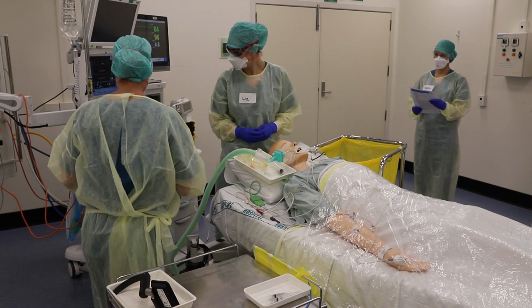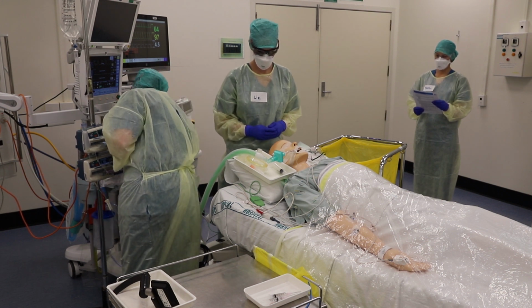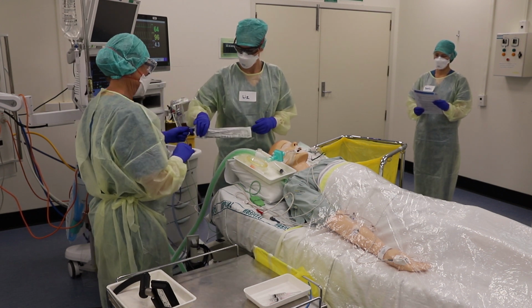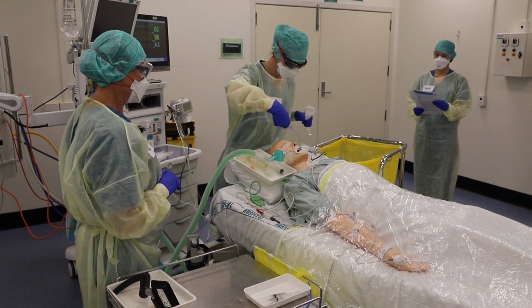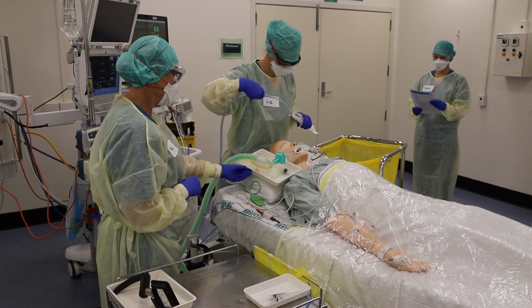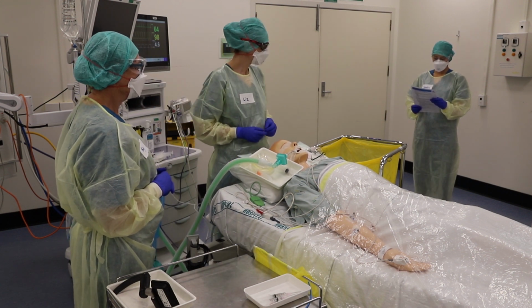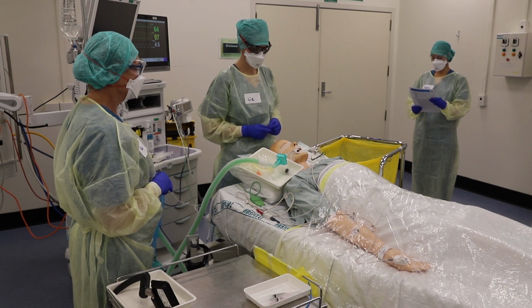We will suction the airway, thanks, Kate. Suction's on. Okay, so the airway is suctioned. Technique for smooth emergence instituted.